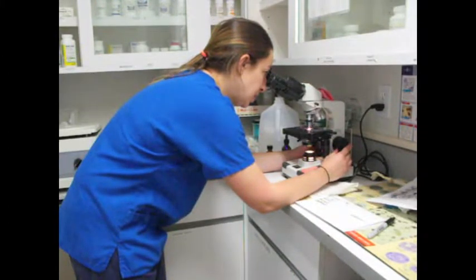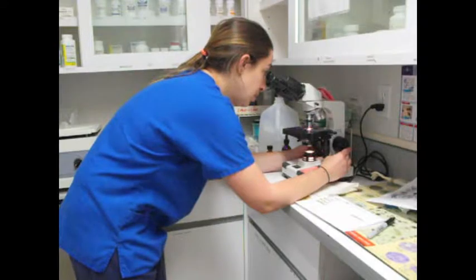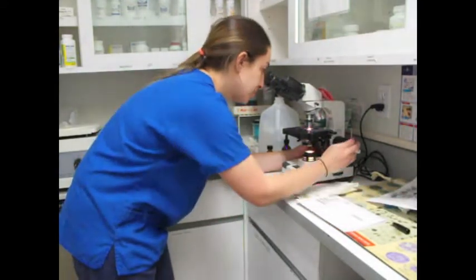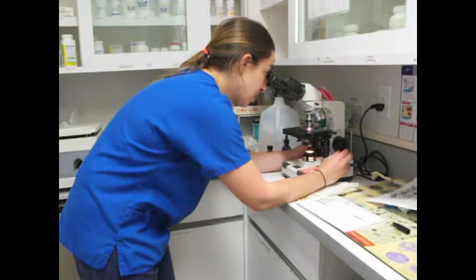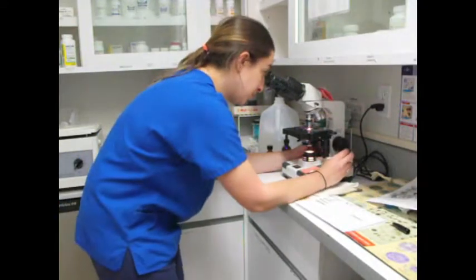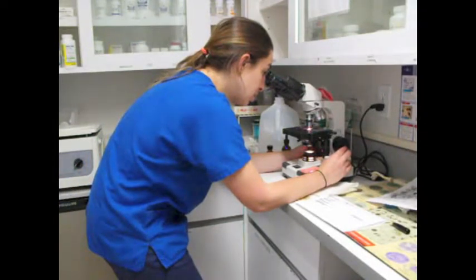I see 1 monocyte. Actually, I see 7 neutrophils in this field, 1 monocyte. I see a large number of platelets, but we will count that after.